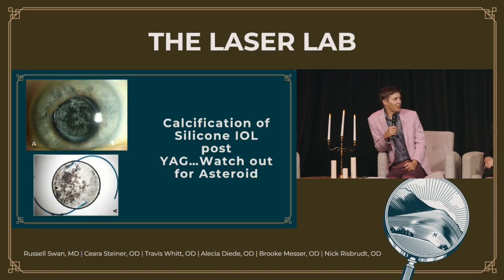Yes, all silicone lenses have to be 3-piece because a silicone haptic is too mushy, too soft to actually hold itself in the capsular bag, and they would fold around it. So all silicone lenses are 3-piece, typically. But you can have a hydrophilic 3-piece lens, a hydrophobic acrylic 3-piece lens, or a silicone, or a PMMA.